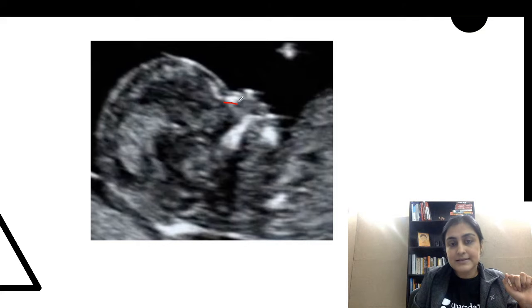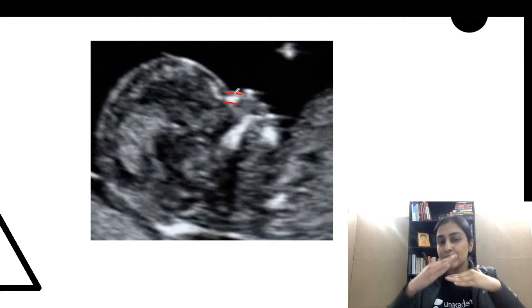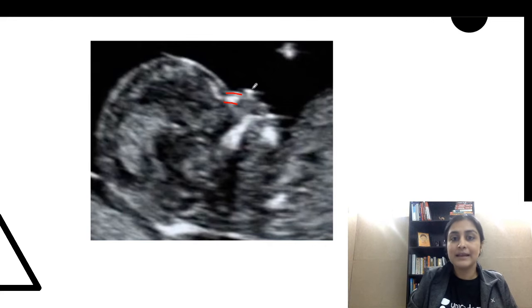Then in the same scan, we also go for nasal bone measurement. So how do we look for the nasal bone? See here, this echogenic thing that you are seeing, this is the nasal bone. Can you see one more echogenic line above this? This is the skin above the nasal bone. So you have nasal bone, you have the skin. These two form a sort of equal sign. And we should see one more echogenic dot, which will be the nasal tip. So this is how we see the presence of nasal bone.